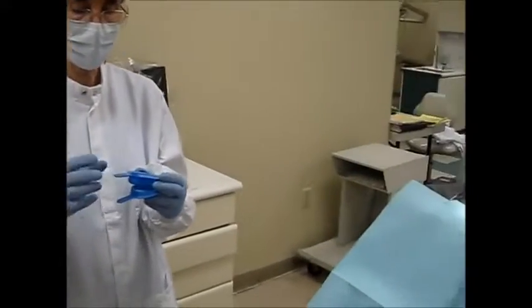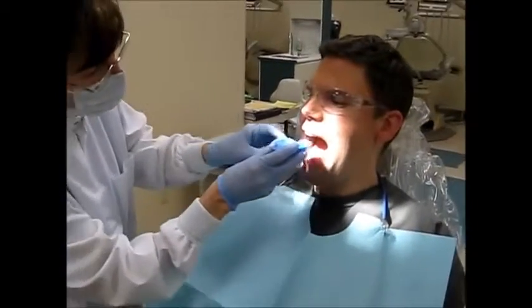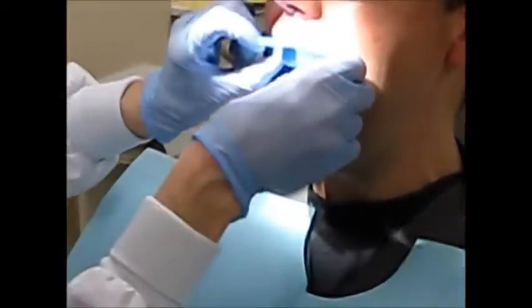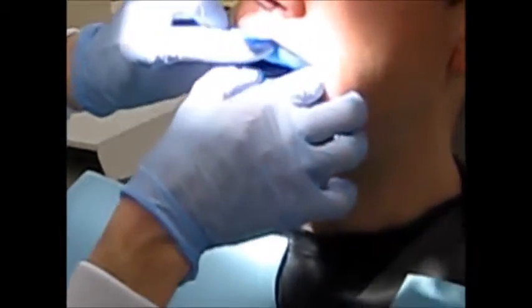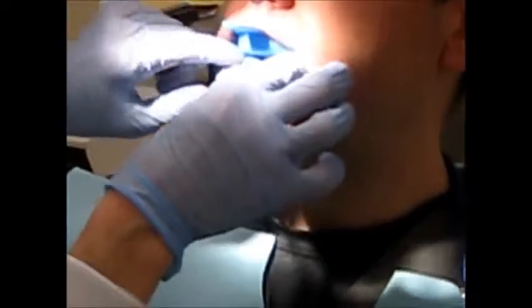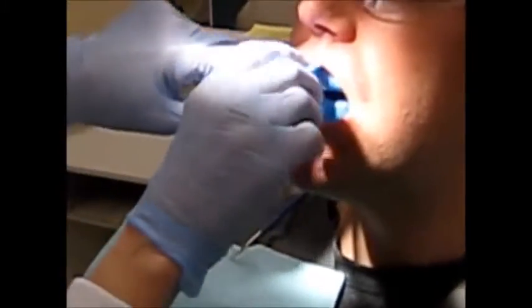that it fits. With the upside going towards the maxillary arch, I would ask the patient to open. I would seat the tray on the maxillary and mandibular, ask the patient to bite down, and I would assess to ensure that the tray fit all around the molar areas, which it does.